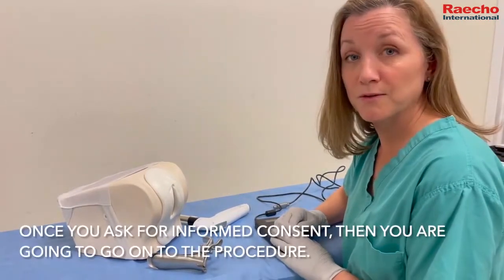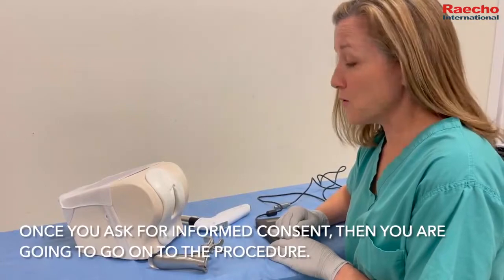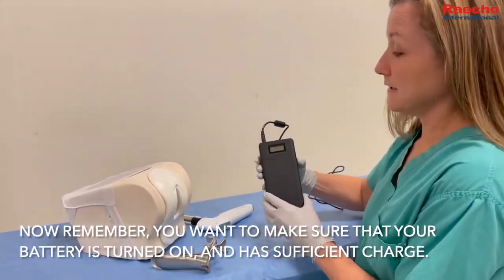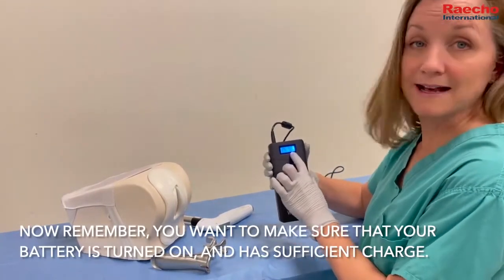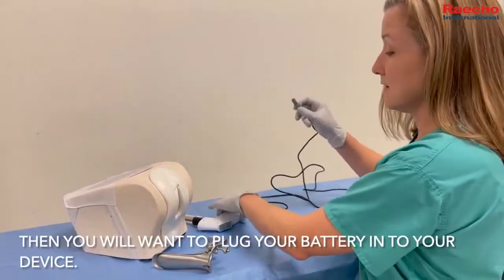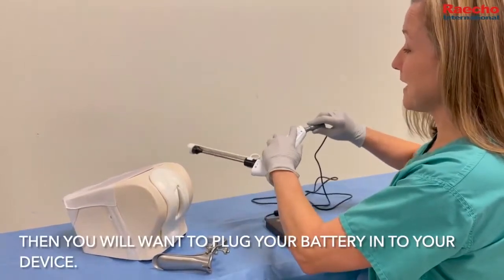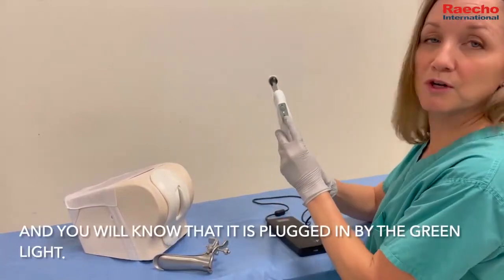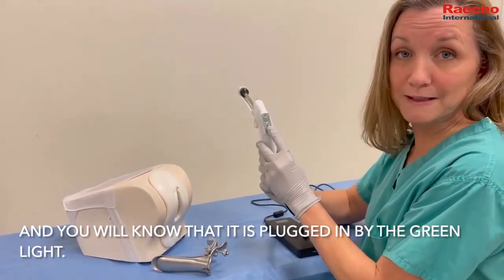Once you ask for informed consent, then you're going to go on to the procedure. Make sure that your battery is turned on and has sufficient charge, then plug the battery in to your device — you will know that it's plugged in by the green light.